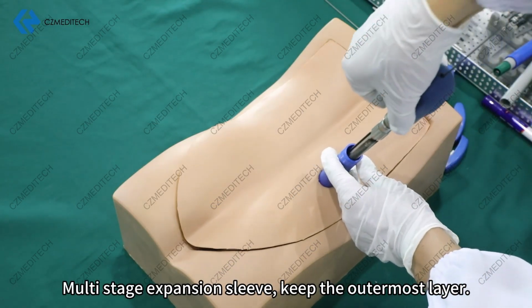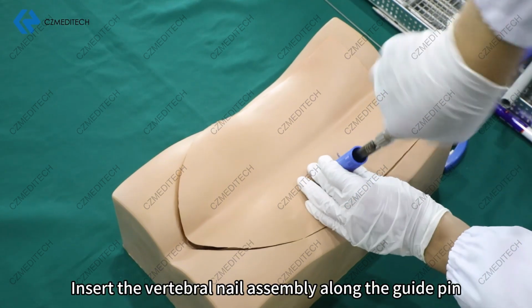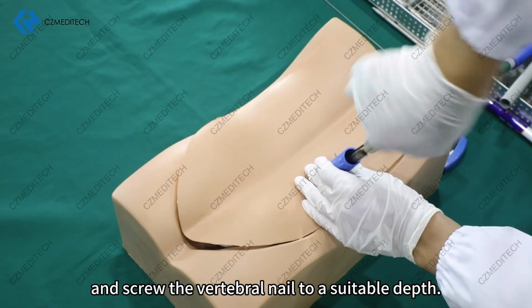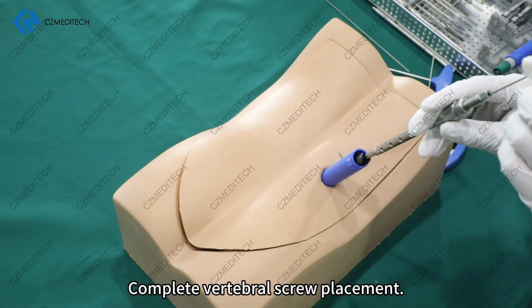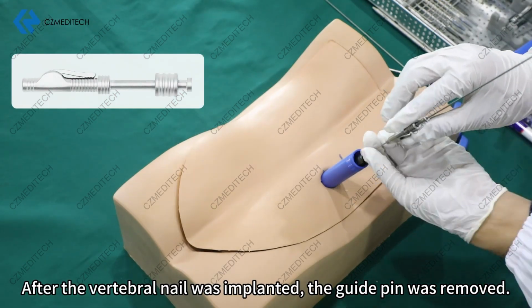Multi-stage expansion sleeve. Keep the outermost layer. Insert the vertebral nail assembly along the guide pin and screw the vertebral nail to a suitable depth. Recheck the screw-in state of the vertebral nail under X-ray. Complete vertebral screw placement. After the vertebral nail was implanted, the guide pin was removed.